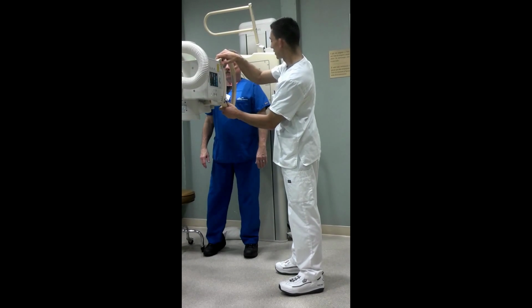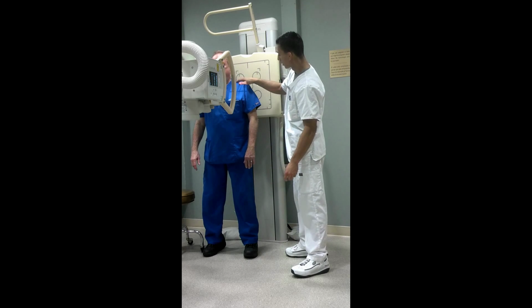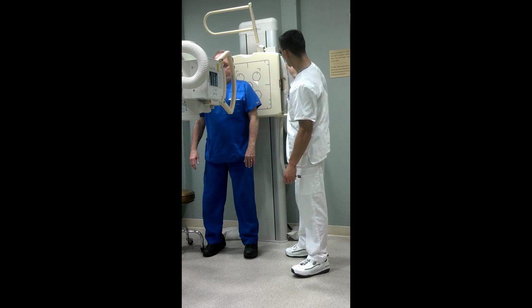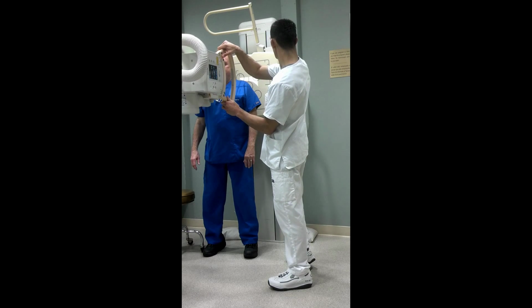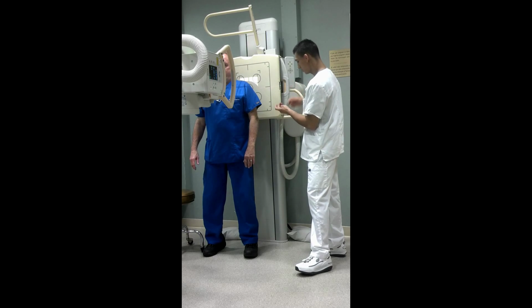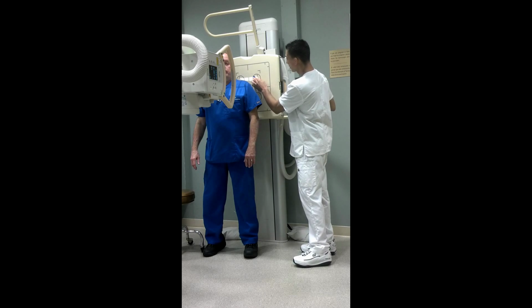And the central ray is going to be basically perpendicular to the coracoid process, which is just a soft spot here. Right about there. Do the left shoulder, get my marker in there.